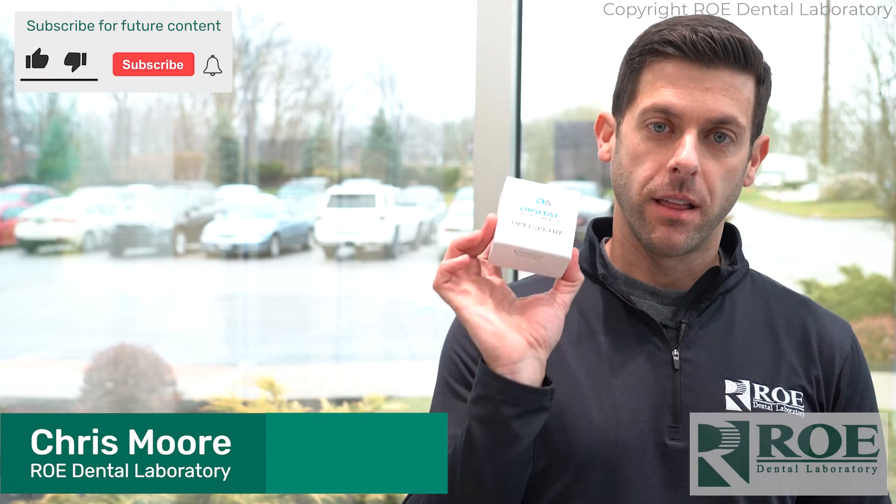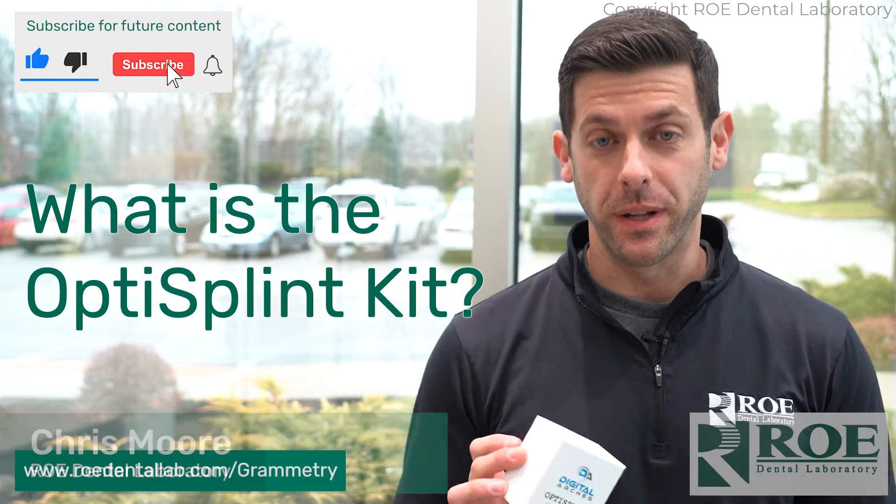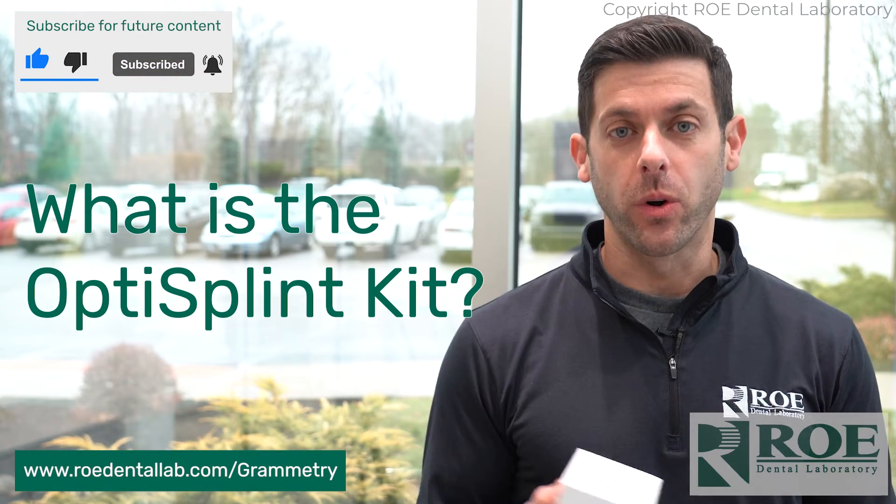Hey, it's Chris from Rho Dental Laboratory, and today I'm talking to you about this guy right here, OptiSplint. What is this, and how does it work?